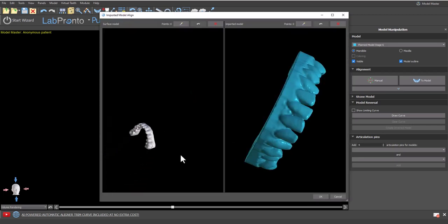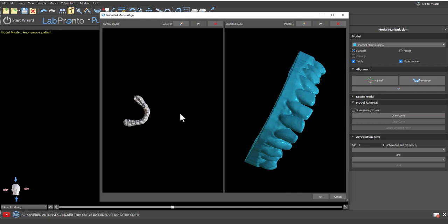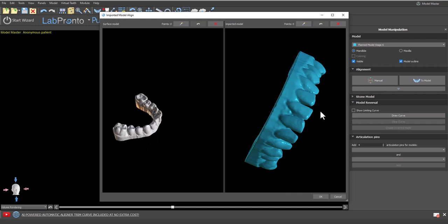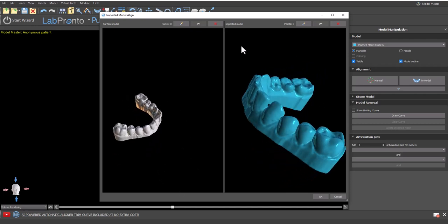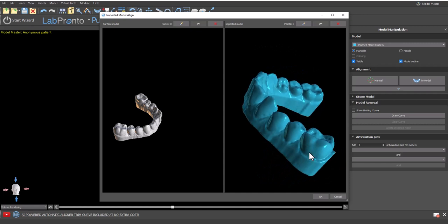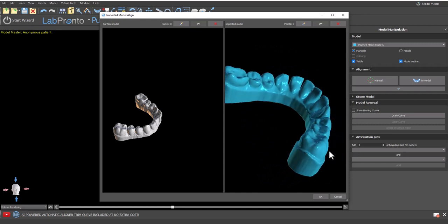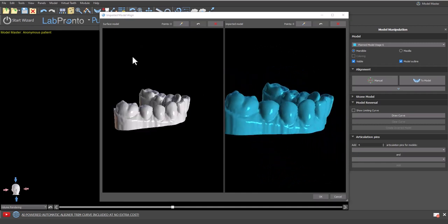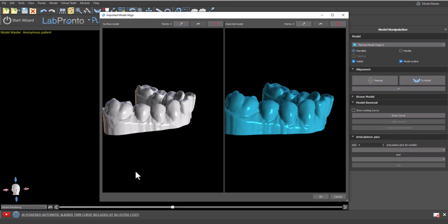What we're going to be doing at this point is placing a series of points on the corresponding anatomy of each scan. We want to select the points precisely and it is a good idea to place on the gingival level so that if there is any deviation between the models, we're selecting points with little or no deviation.